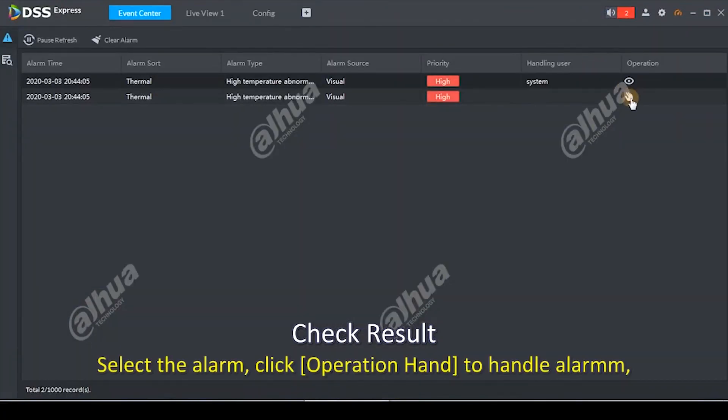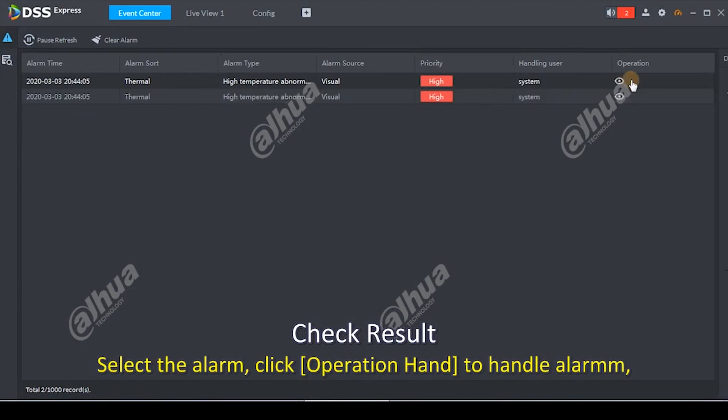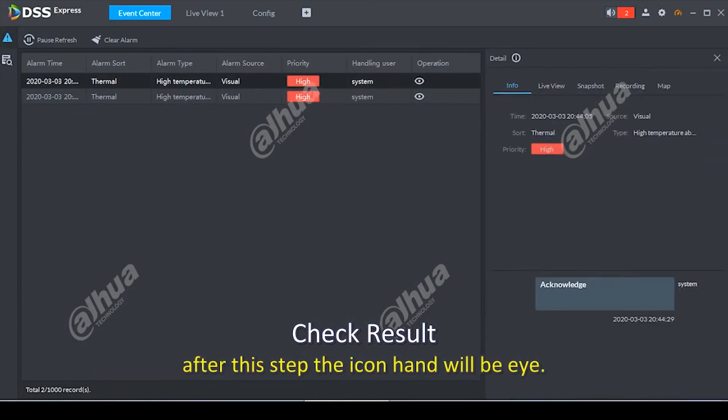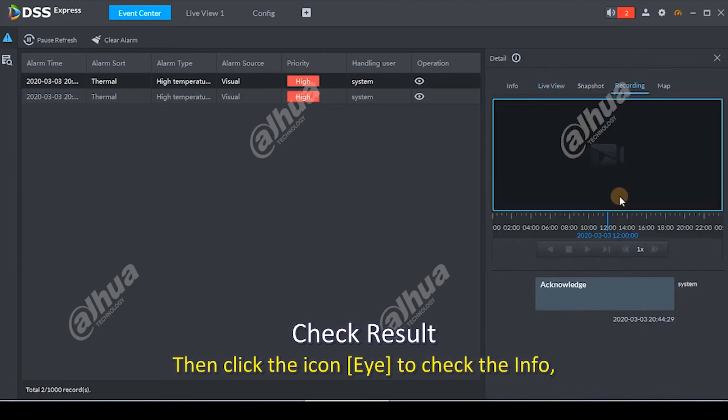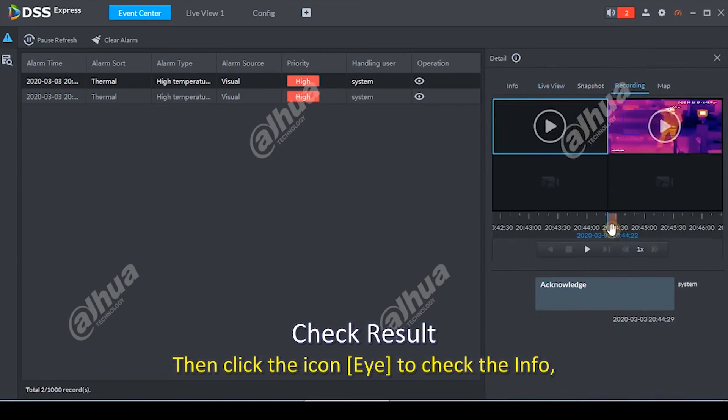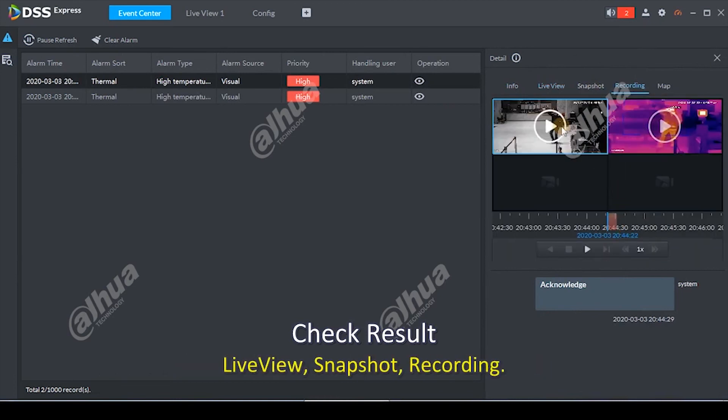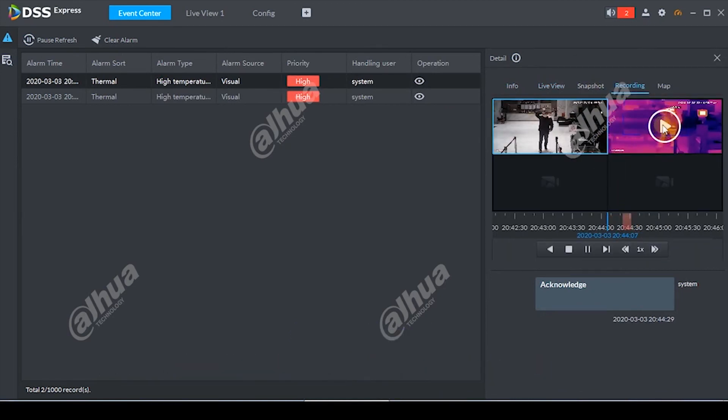Select the alarm, click Operation Hand to handle. After this step, the icon hand will be eye. Then click the icon eye to check the info, live view, snapshot, recording.